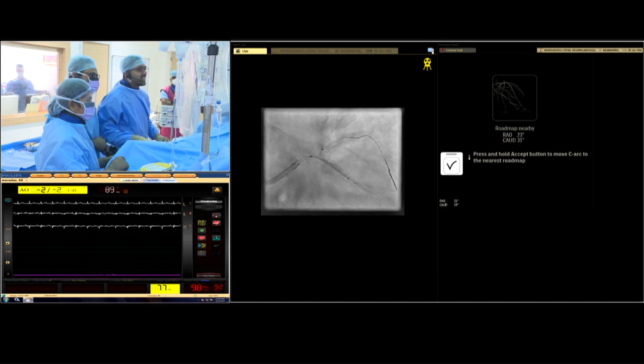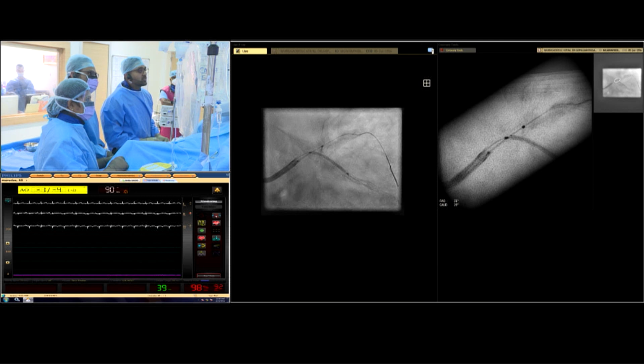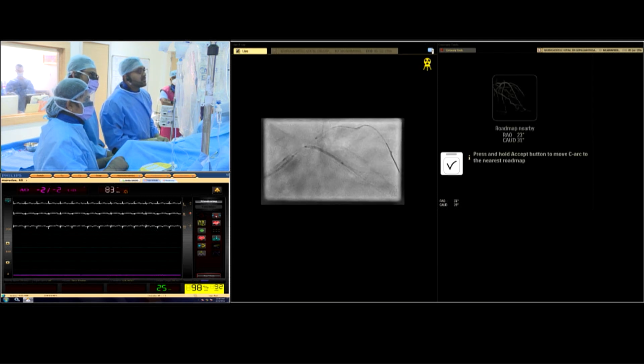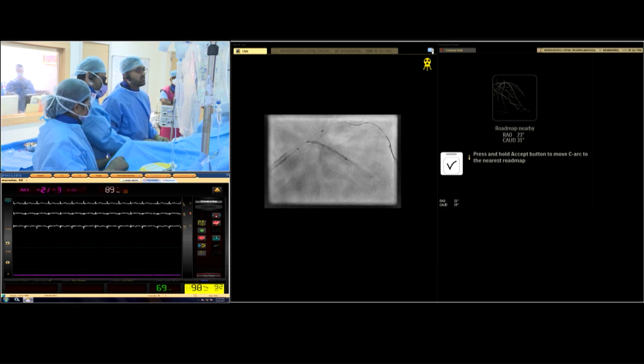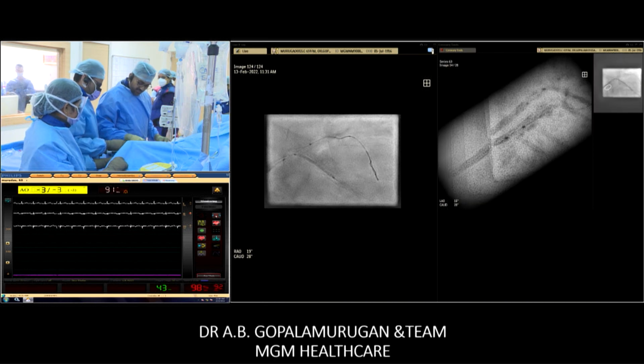So it looks okay there. What do you think, panelists? There, it's probably too much here. Some other angle. See, this is too much. Just give us another view, please. Go to spider, guys. Everything connected?